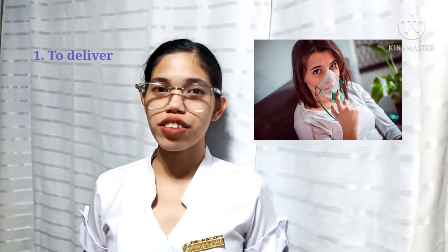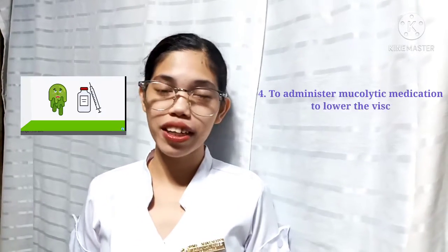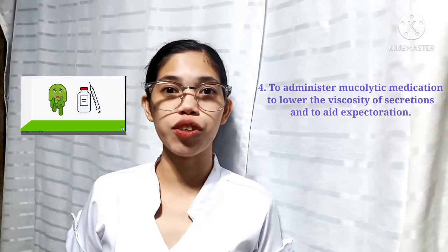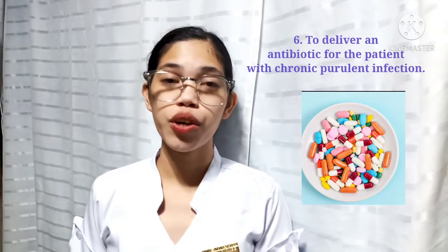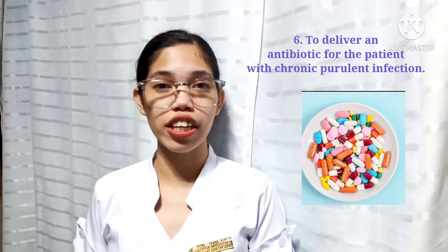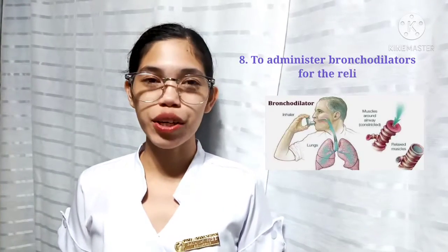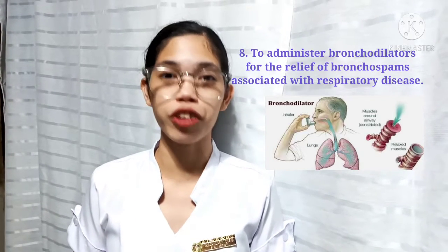The objectives are to deliver aerosol medication to promote better ventilation, prevent or treat atelectasis, to administer mucolytic medication to lower the viscosity of secretions and also to aid expectoration, to decrease pulmonary edema, to deliver an antibiotic for the patient who has a chronic purulent infection, and also to decrease the work of breathing, to administer bronchodilators for the relief of bronchospasms associated with respiratory disease.